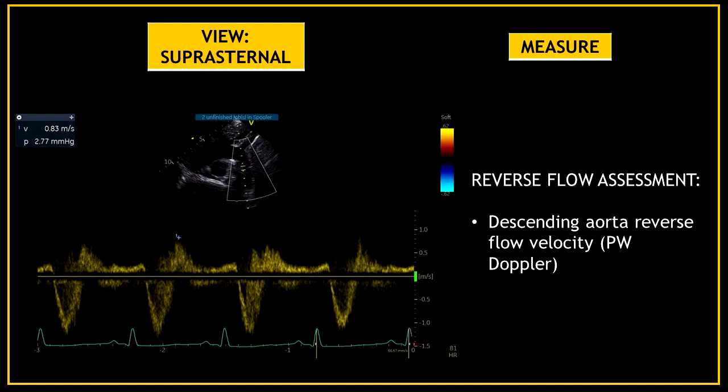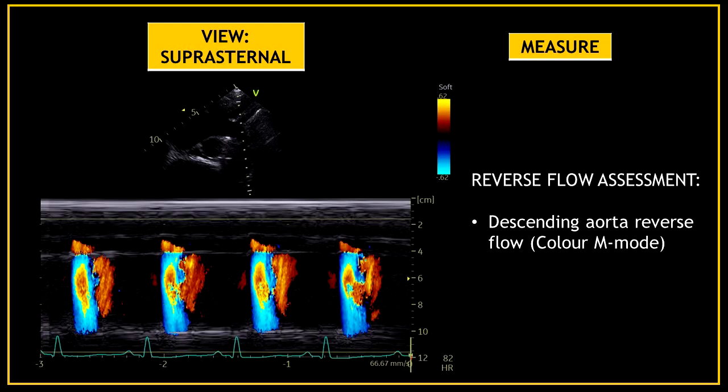In the presence of aortic regurgitation, you can assess for reverse flow on the descending aorta. Use pulse wave Doppler on the descending aorta and measure the reverse flow velocity. You can also use color M-mode on the descending aorta to look for any reverse flow.